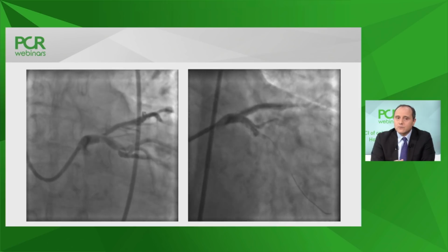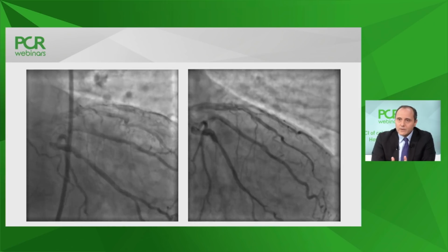Now, my question to Chris would be, do we always need to do rotational atherectomy in distal left main or in calcified left main stenosis? I think rotablation is a very nice tool, and it's frequently underused because it can make your life easier, especially in these situations where you have this enormous chunk of calcium.